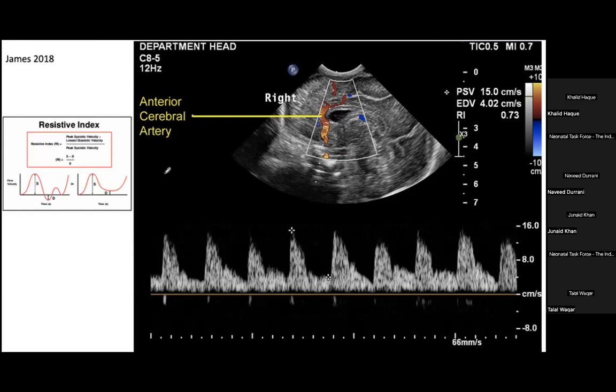And the conditions in neonatology mainly are hypoxic ischemic encephalopathy or low PCO2. And the resistance index is also inter-observer variable, and it gives you a fair amount of clue about sensitivity and specificity about the future neurodevelopmental outcome based on the resistance index.